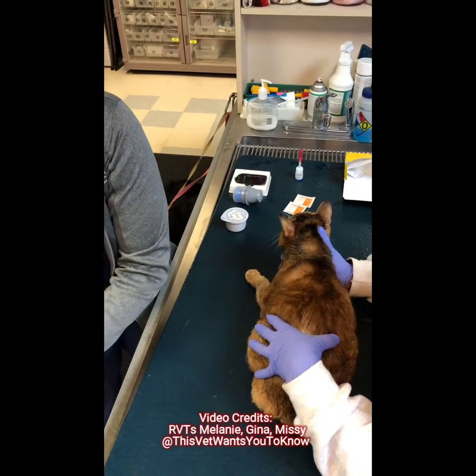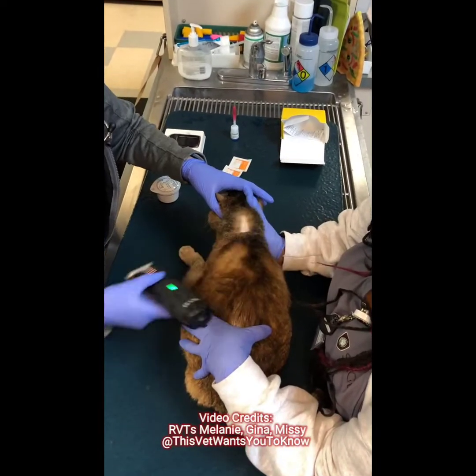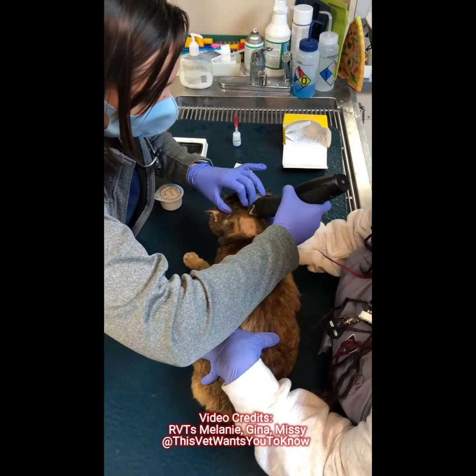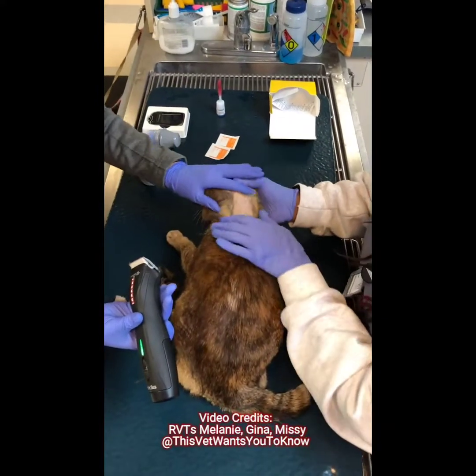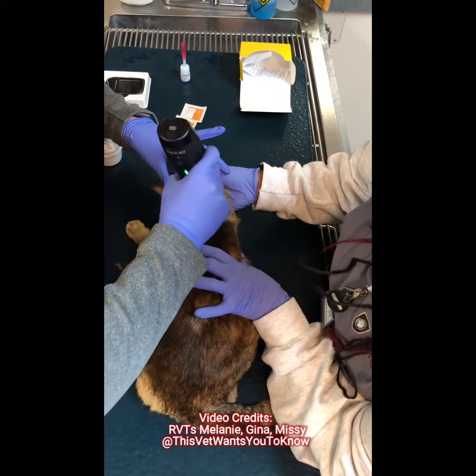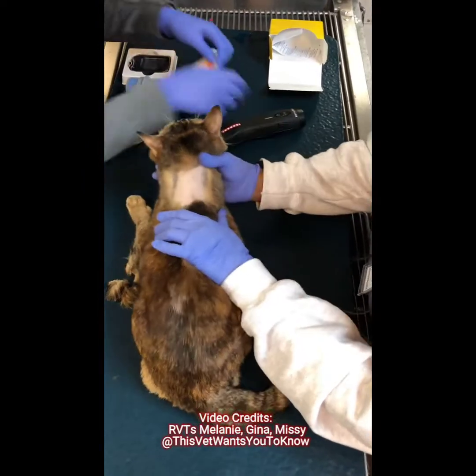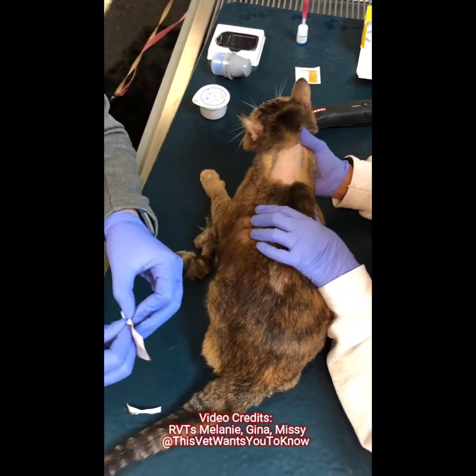It usually helps to have someone help you hold, just to make sure she stays still. We're just going to shave a two-by-two or three-by-three square — just enough hair for it to be able to stick. That should be plenty. Now we're going to use our alcohol wipes to clean the skin and make sure we get all the extra hair off.